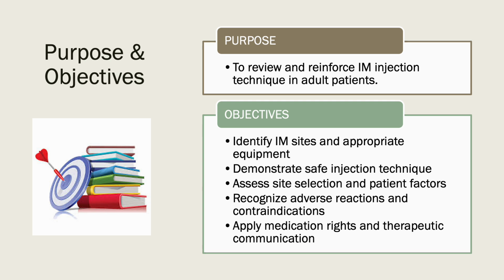The purpose of this session is to ensure you're well prepared and clinically competent in administering IM injections to adult patients. This is more than just a checklist item. It's a moment of trust and skill, and it's also responsibility in nursing care.